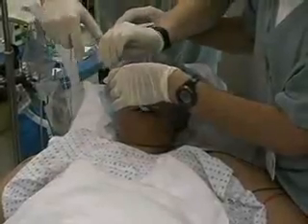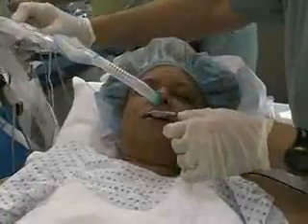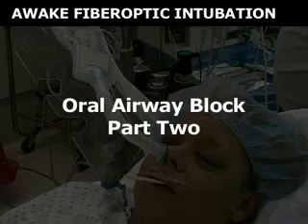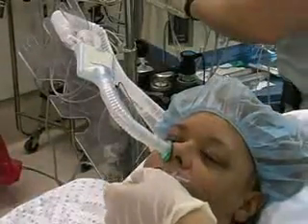Insert the trumpet into the patient's naris. Connect the corrugated adapter to the breathing circuit. Turn on the oxygen flow to 10 liters per minute to improve oxygenation. Remove the tongue depressor from the patient's mouth.